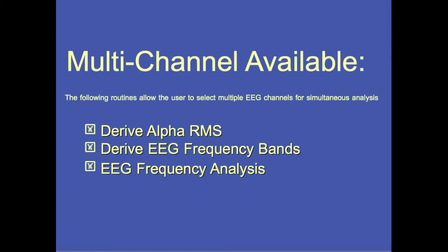Multi-channel analysis is available for the Derive Alpha RMS, Derive EEG Frequency Bands, and EEG Frequency Analysis routines.